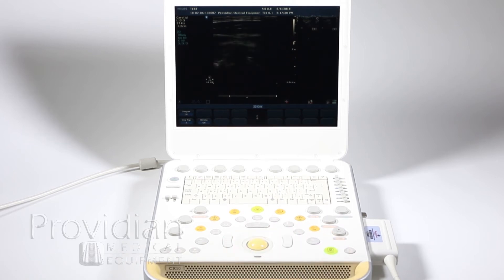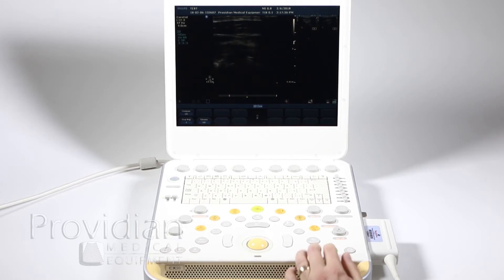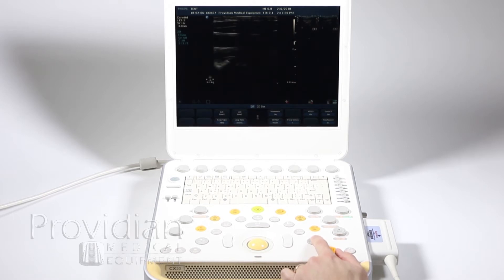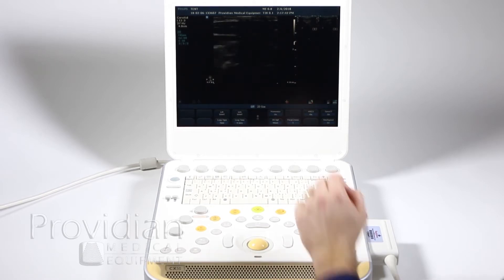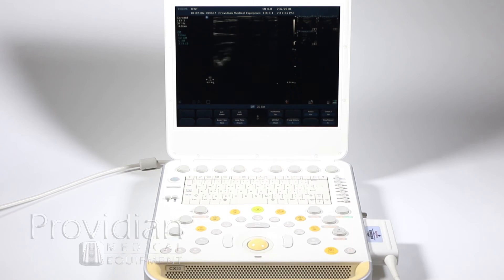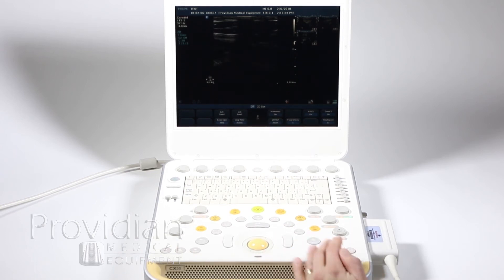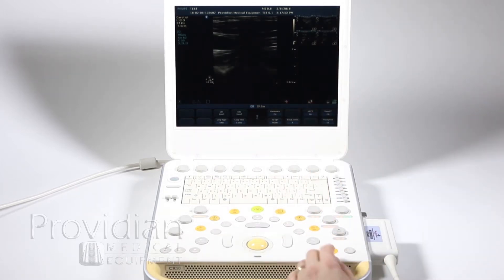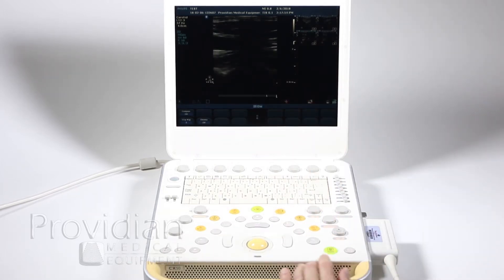Now if I want to save a loop, there are two different ways to save that. One is to unfreeze the image, then hit Acquire, and it's going to save a loop based on how long it's set up. So if you can hear the beeps, I'm hitting Acquire — it's now saving three seconds and putting it up there. I'll go ahead and freeze that image.